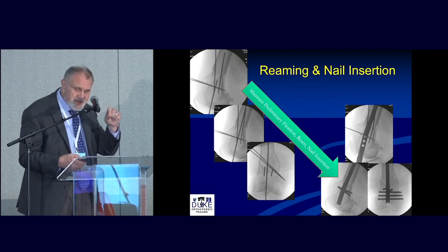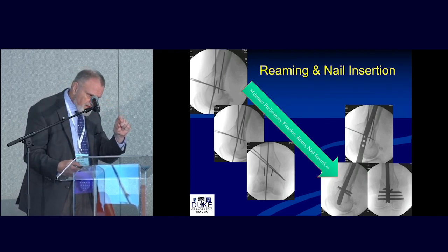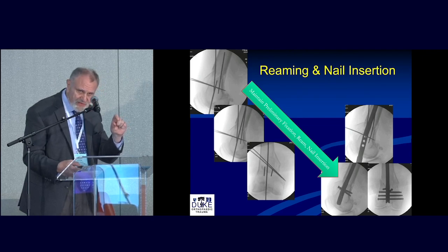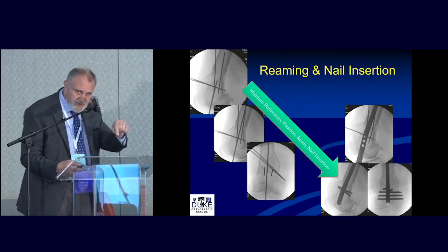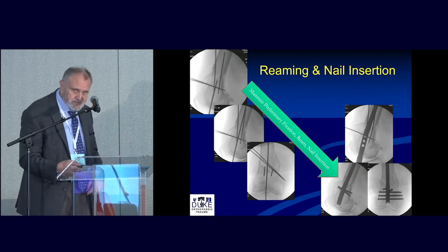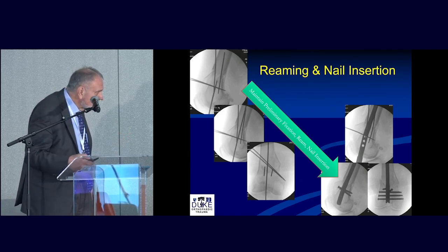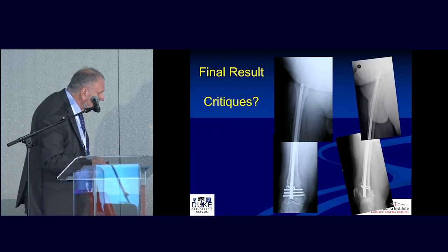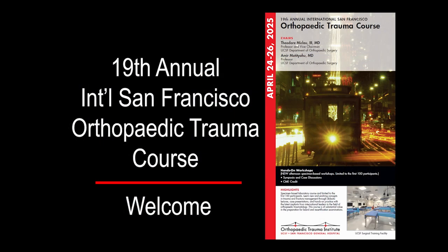In some of the Synthes sets, they have a bit where the distal half inch is a drill bit and the rest of it's a smooth pin. Those I will use as my blocking screws and then put the nail in and then substitute them for screws at the end. One of the companies has a jig that did that. Right, right. So I just wanted to show that, because we were discussing. Great. Fair enough.